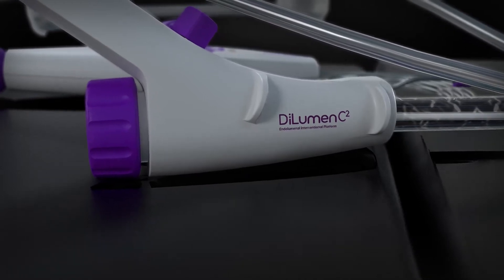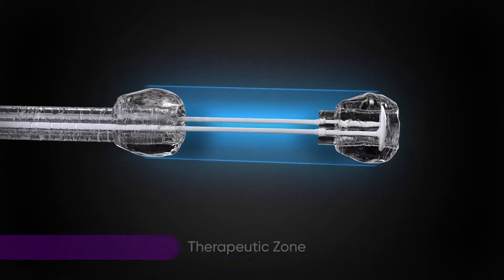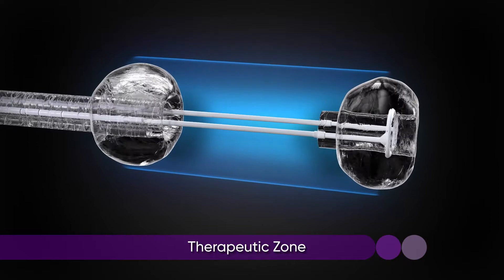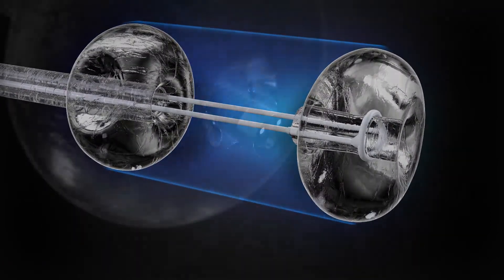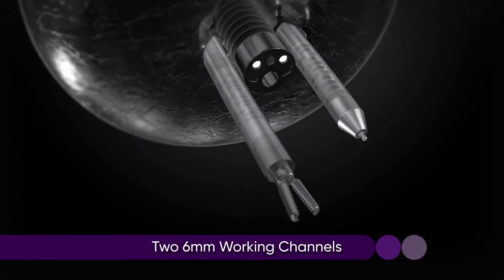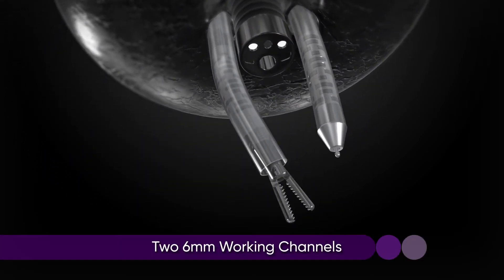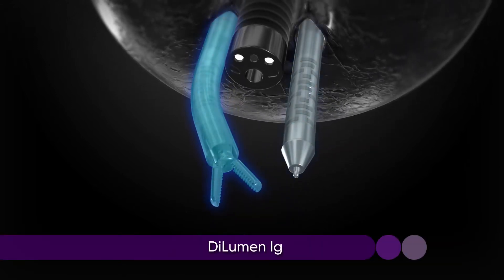The Lumendi DiLumen C2 is an endoscope accessory consisting of a dynamic dual balloon system that creates a therapeutic zone to enhance visualization, diagnosis, and endoscopic treatment. In addition, it incorporates two 6mm working channels at the 3 and 9 o'clock positions. These channels accommodate the DiLumen IG Grasper and IK Knife.